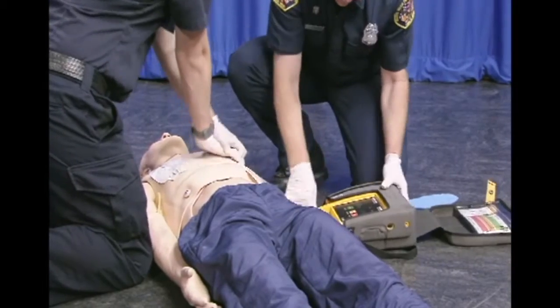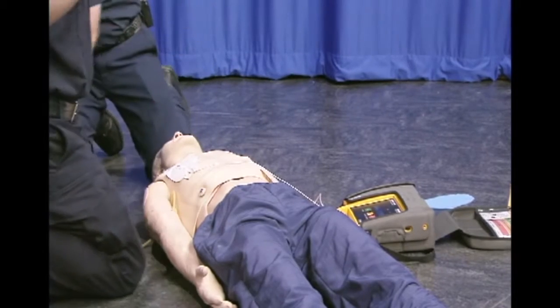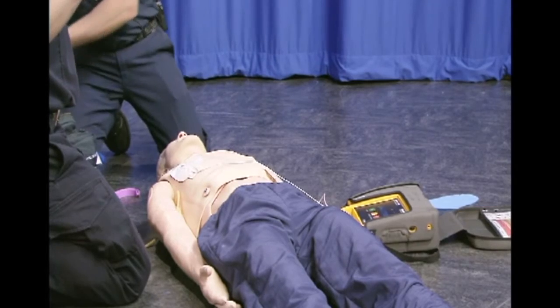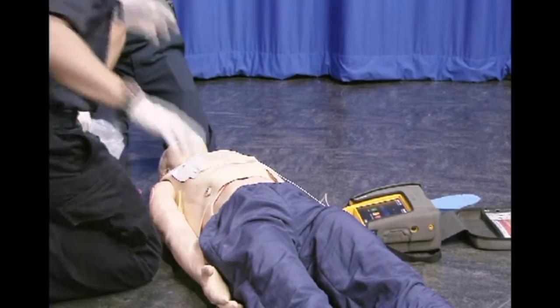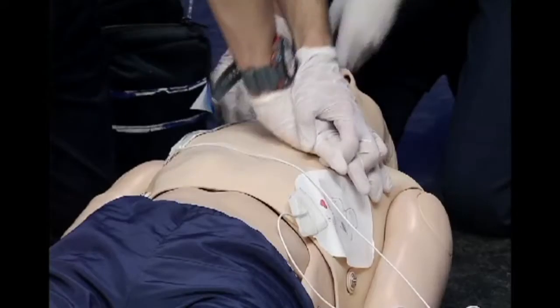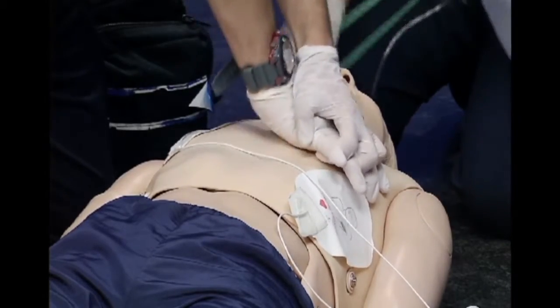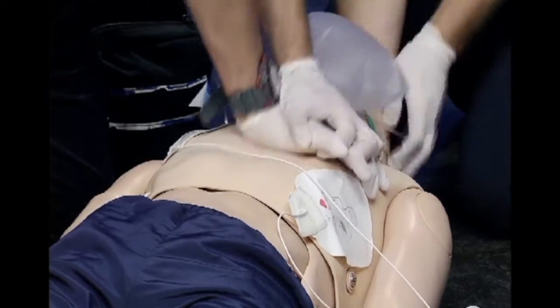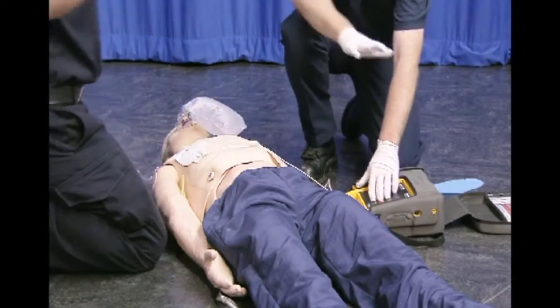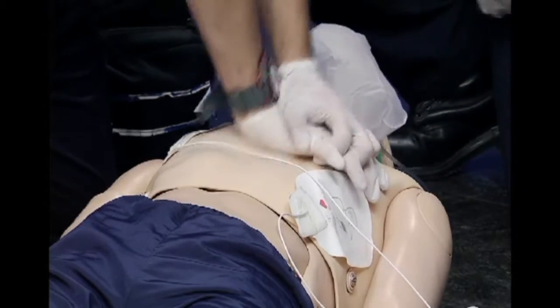After the AED is placed, compressions are briefly stopped while it analyzes the rhythm. If no shock is advised, continue CPR for 200 compressions. If shock is advised, perform 30 compressions while the AED charges. While defibrillating, maximum time off the chest is 5 seconds. A non-rebreather mask is placed over the patient's mouth and nose with oxygen delivered through passive ventilations. Start CPR.